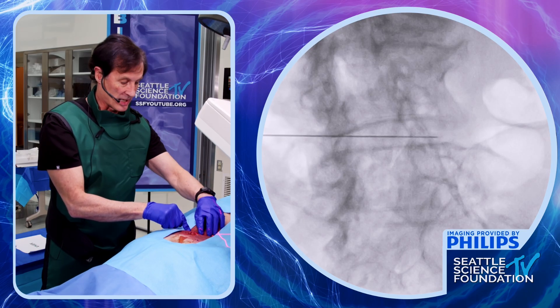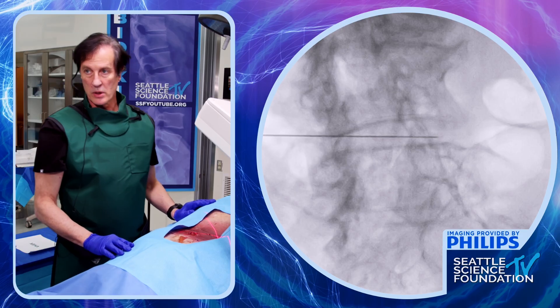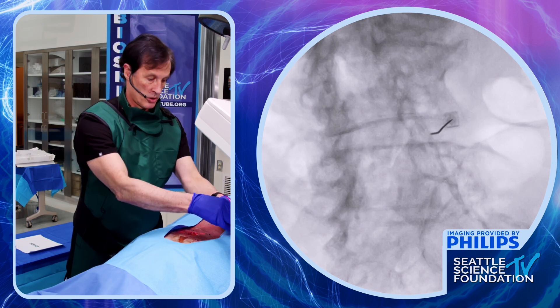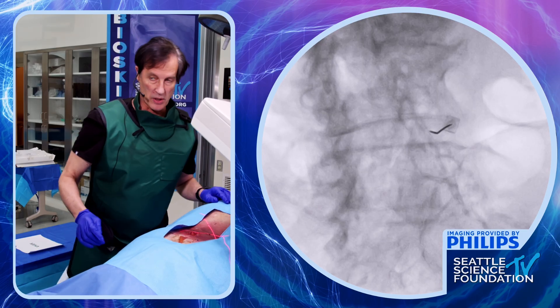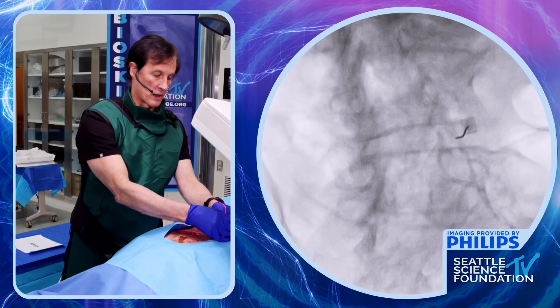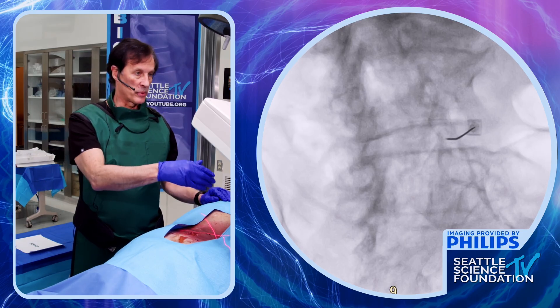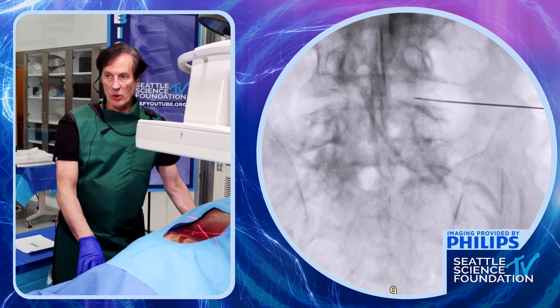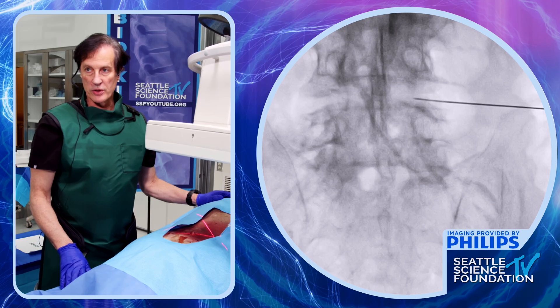We're going to start directly to spare the SAP — the superior articular process. Starting with the 20-gauge needle right there, we're going to come down aiming toward the SAP. Ideally we'd like to hit the superior articular process to have a depth stop. I can feel the SAP there. I'm going to turn it around, go past the SAP, then turn back. We're going through Kambin's safe triangle, placing it toward the center — very nearly toward the center on the AP.